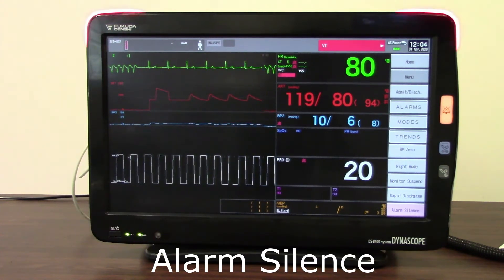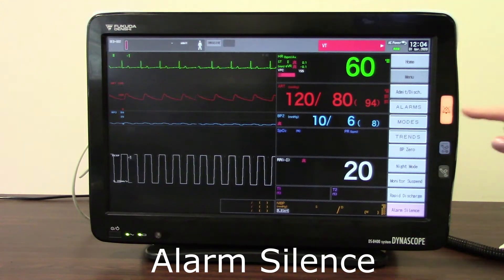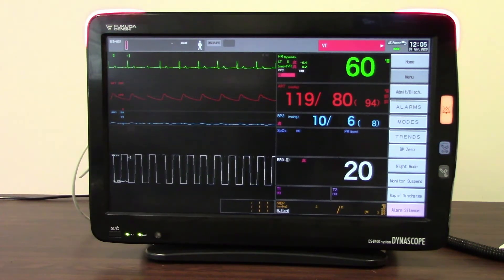Even though it's displaying a normal sinus rhythm, it's going to continue to flash for another good few seconds, just to ensure that you have seen it and noted it. The button will remain lit until that alarm silence is up — so until the one minute is finished.